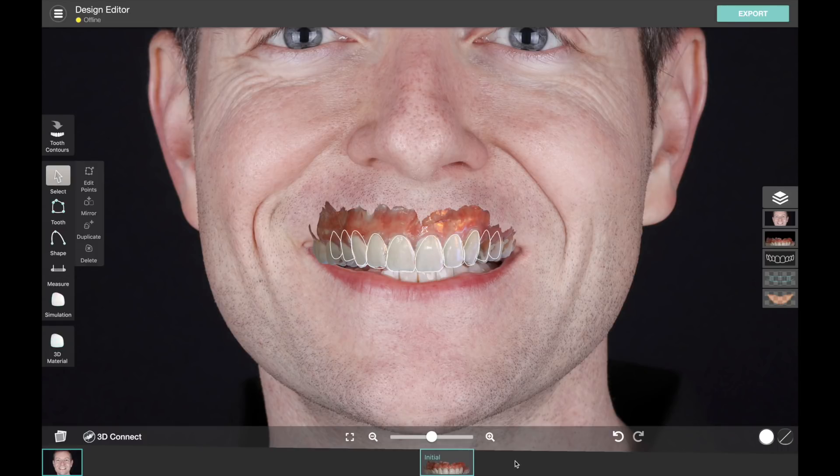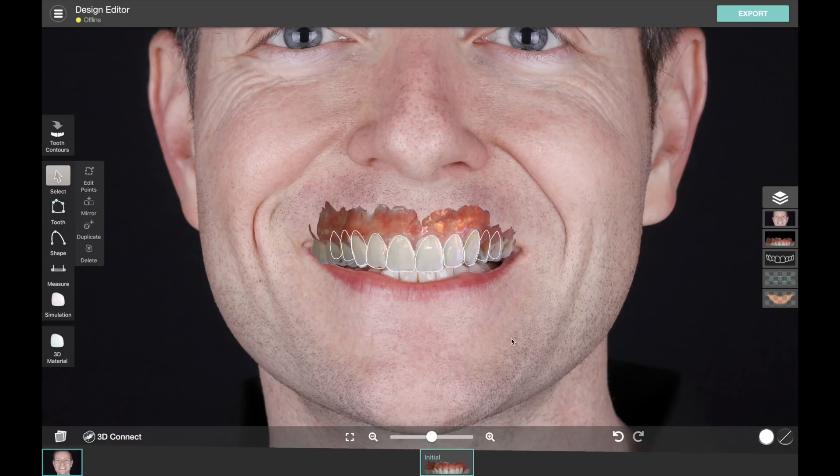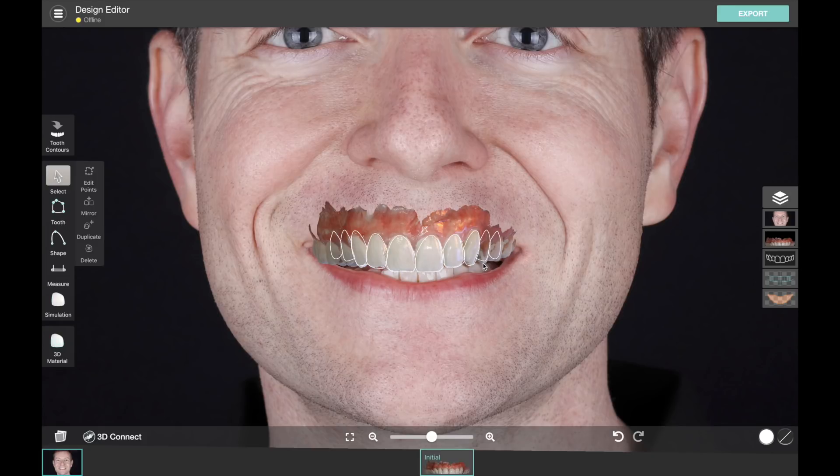If we bring in other model files, we can actually use this for quality control as we go through the process. For example, if we had a pre-prosthetic ortho plan, we could bring in the STL file of the teeth in their final position and make sure that we're moving the teeth into the correct place so we can restore.